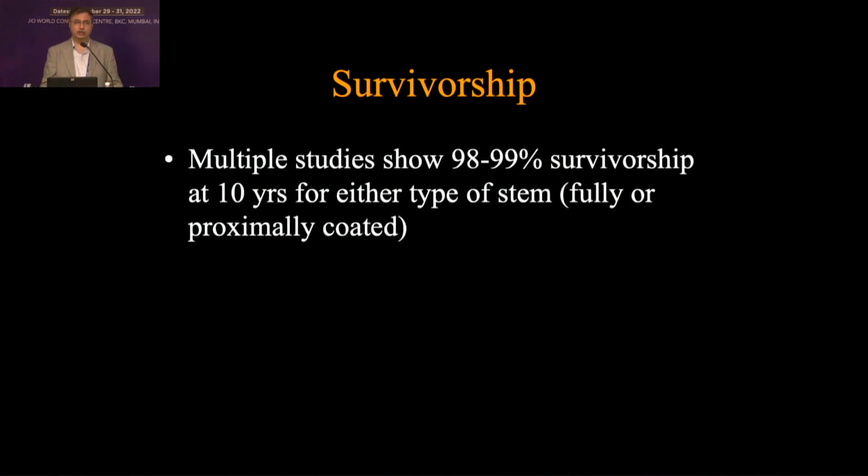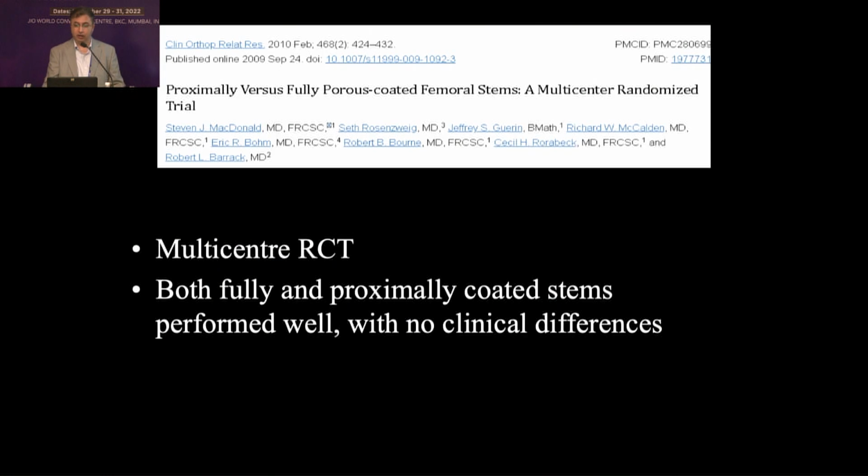Now, whether you consider a proximally coated stem or a fully coated stem, multiple studies have shown that you have 98 to 99% survivorship at 10 years for either of these stems. So it really doesn't matter technically which stem you're going to use.